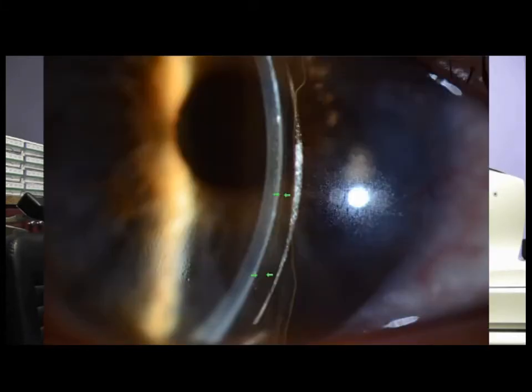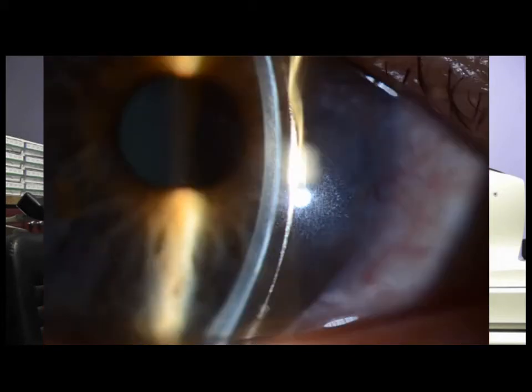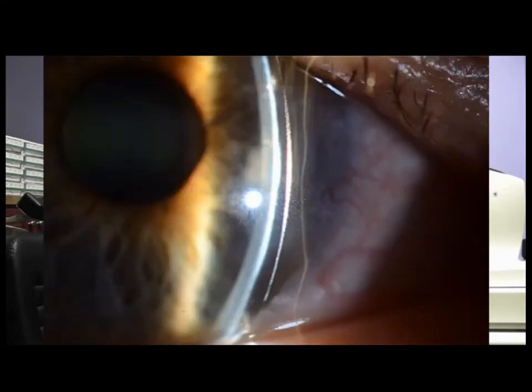So you can see with my slit beam we have vault centrally. It's about one third of the thickness of the cornea. And then as we move more nasal, that vault disappears. So my guess is that if we look at the OCT, we're going to find that nasally we're bearing right on that cornea. Okay, sit back.